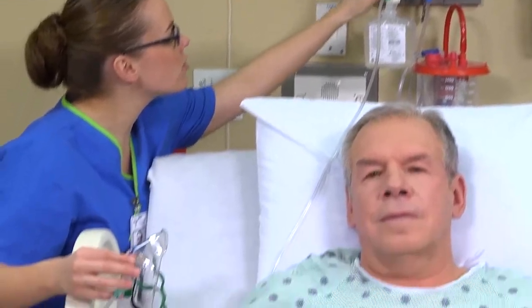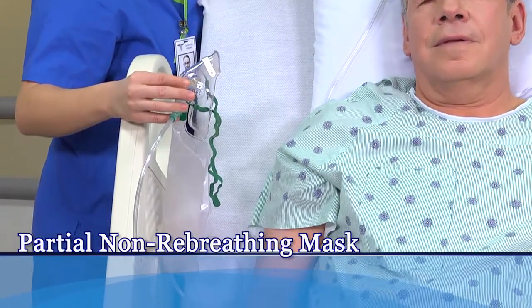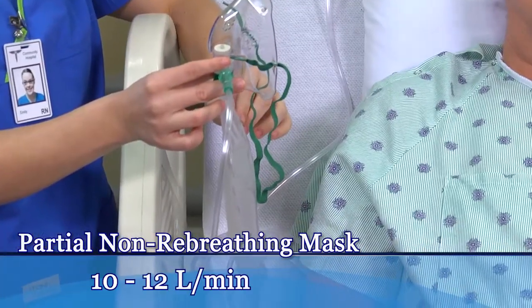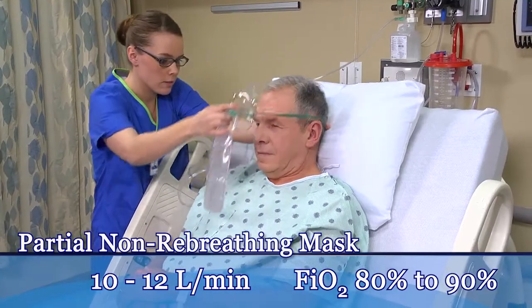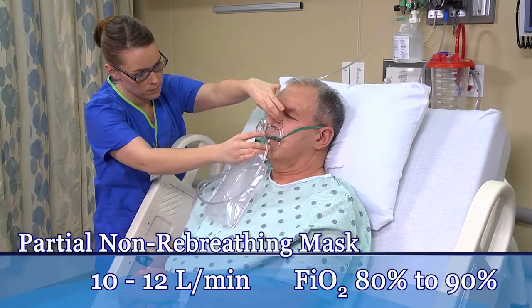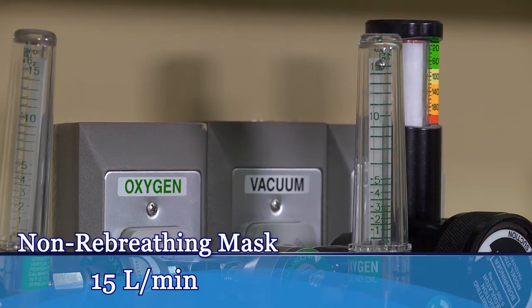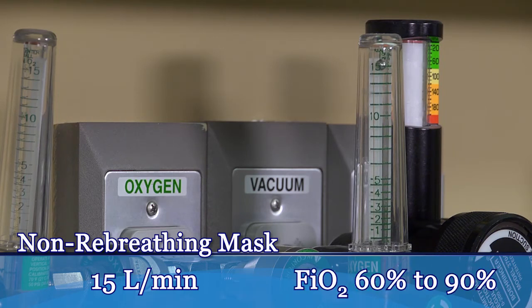The flow rate on a partial non-rebreathing mask must be kept high enough to prevent the bag from collapsing. For example, 10 to 12 liters per minute delivers an FiO2 of 80 to 90 percent. A non-rebreathing mask requires a flow rate of 15 liters per minute, supplying an FiO2 of 60 to 90 percent.